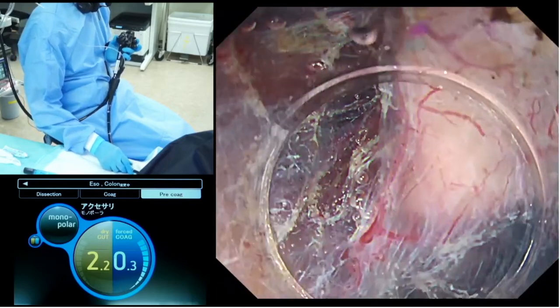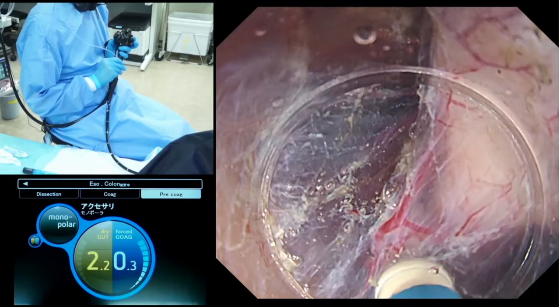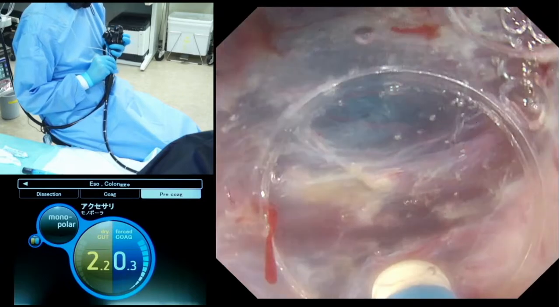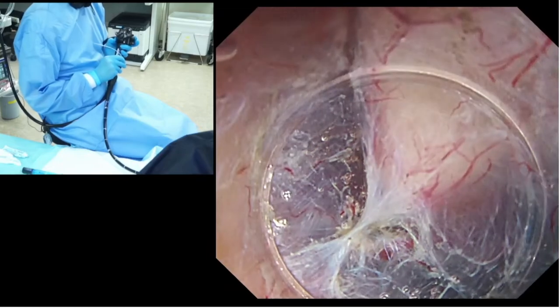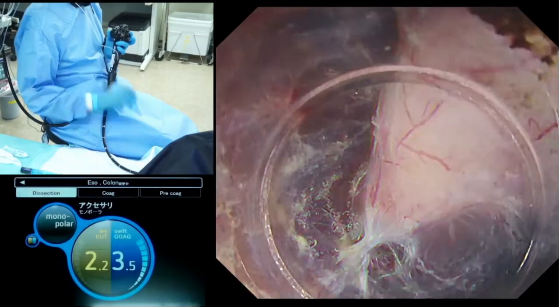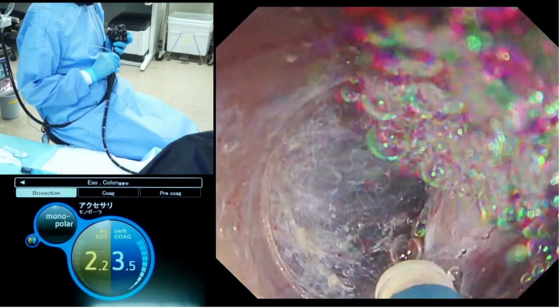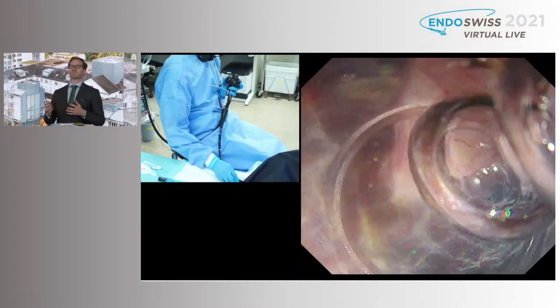I usually switch to a very low setting of forced coagulation, which is 0.3 forced coagulation. Then hook this blood vessel with the open tip of the dual knife and coagulate it until it completely turns whitish. Once the vascular network turns completely whitish, we can safely dissect here without having any bleeding.